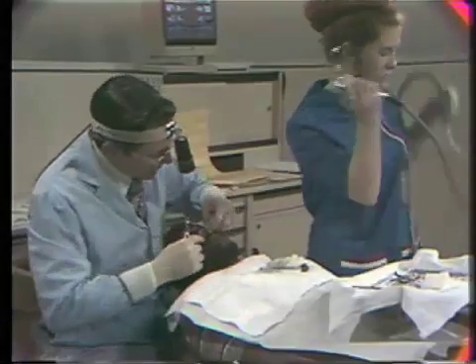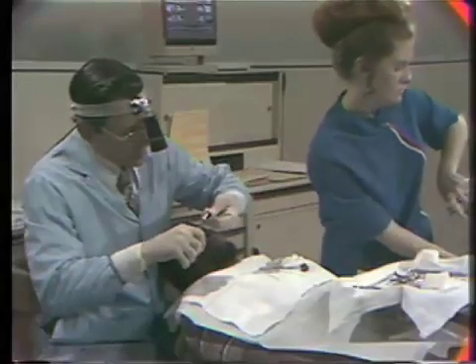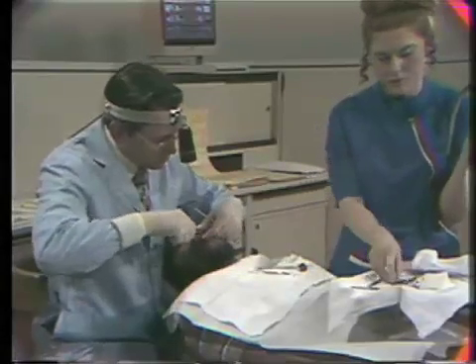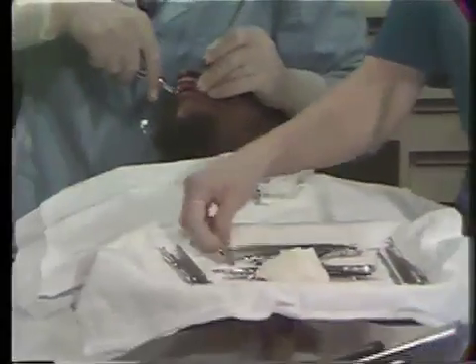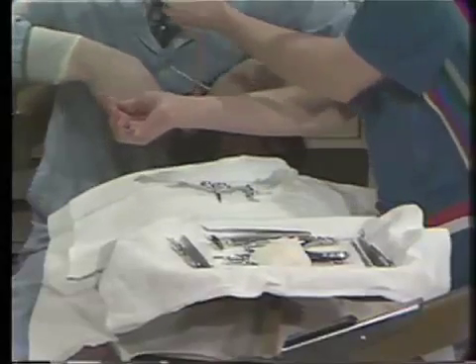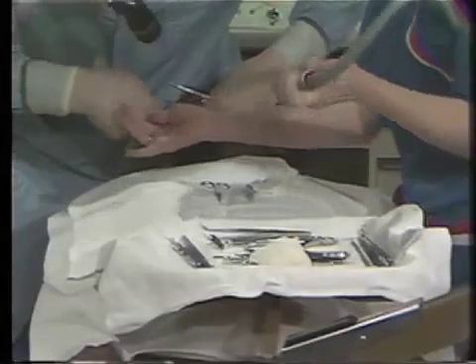Betty has placed a knot in the end of that suture, so that when I pull, it doesn't go through. And I am going to use a continuous suture, and probably one individual suture on the distal of the first bicuspid, where we did a distal wedge procedure. Now you can notice how busy she is over there in that bracket table, getting everything ready for the next phase of the operation, and how she's back in here assisting me all the time.